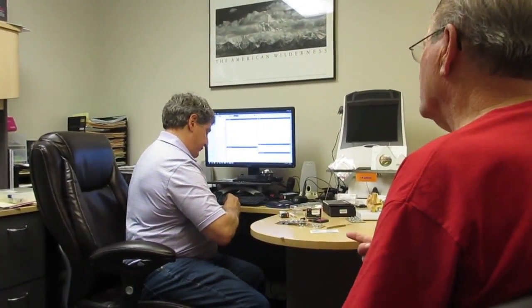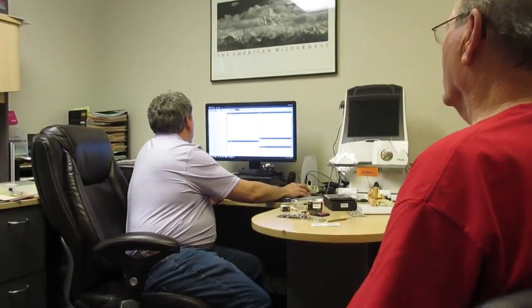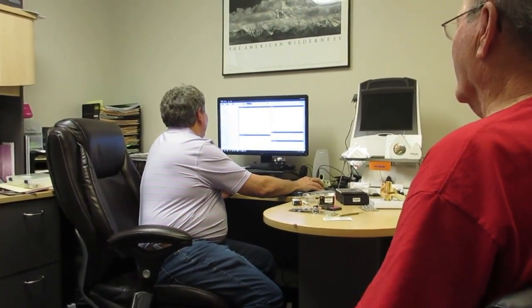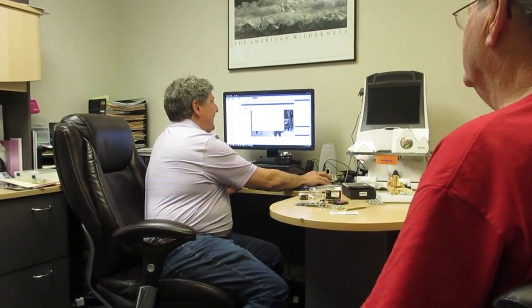Do they have an on and off switch for when I take them out at night? That's off with the battery doors open, and on with the battery doors closed. How will I know the batteries are no good anymore? Either that, or if it happens while you're wearing the instrument, it will give you a signal — a three-tone signal: bing, bing, bing.